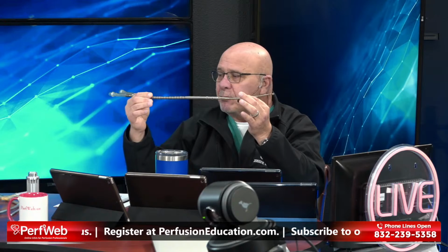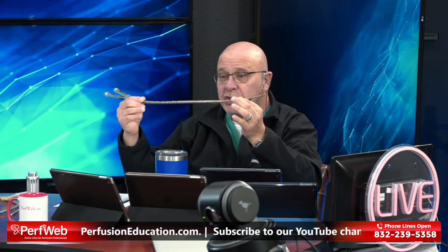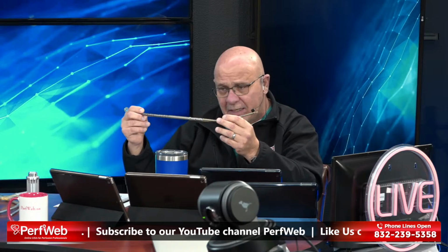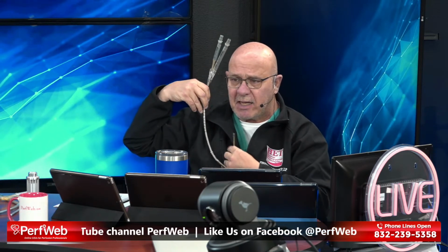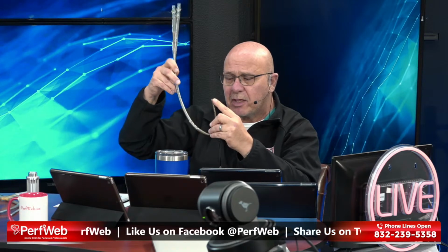And this is the LivaNova Tandem Protect Duo catheter. It is very expensive, but notwithstanding, it is effective. It goes into the right IJ, and it transitions through the tricuspid valve with the tip going through the pulmonary valve into the pulmonary artery.